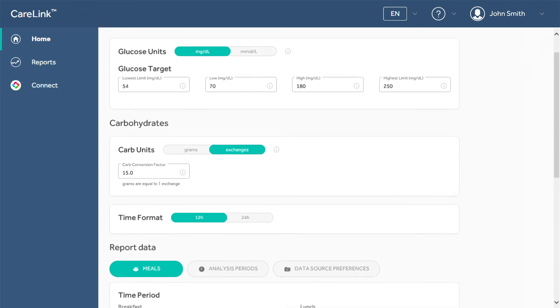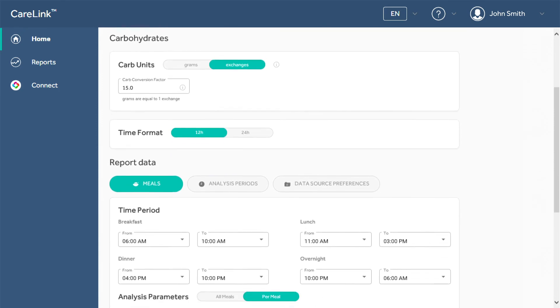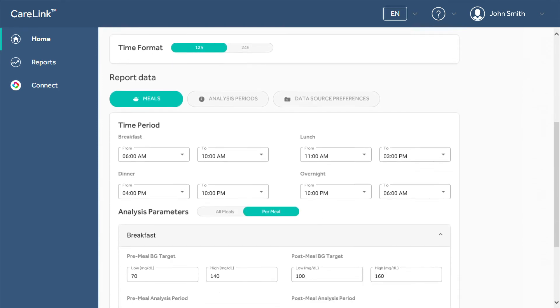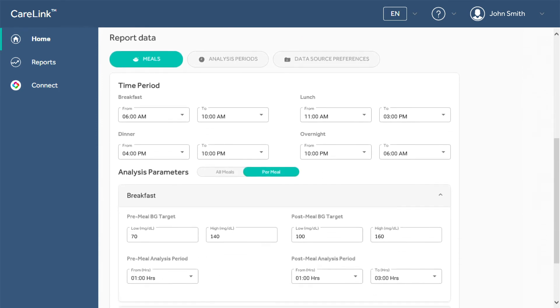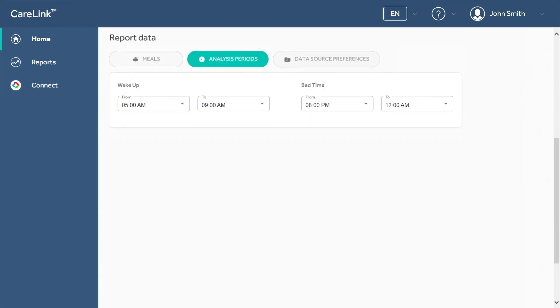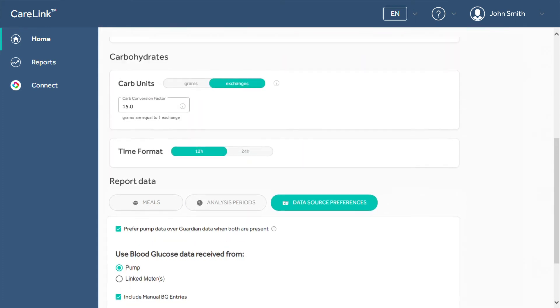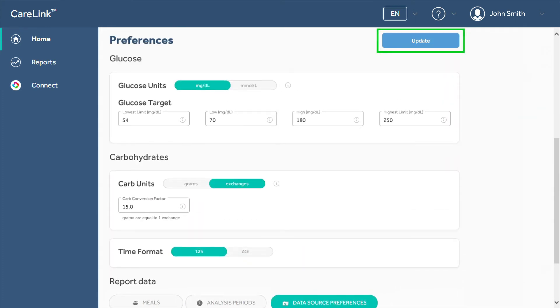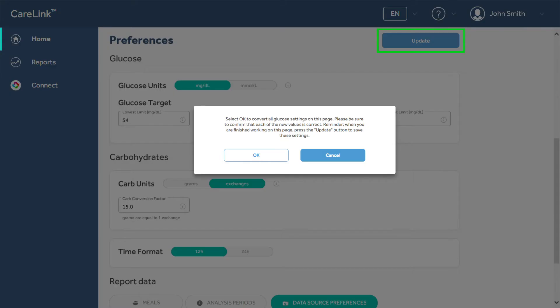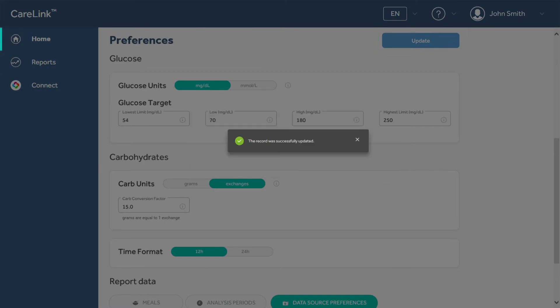When you scroll down in Preferences, there is a section for customizing mealtimes, analysis periods for reports, and your data source preferences. Click Update to save any changes.